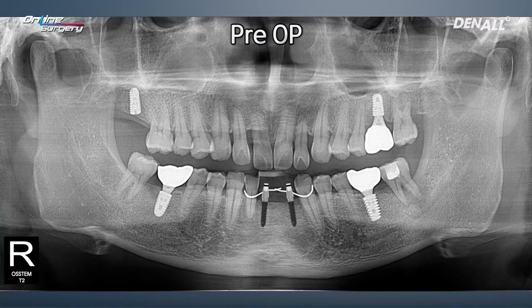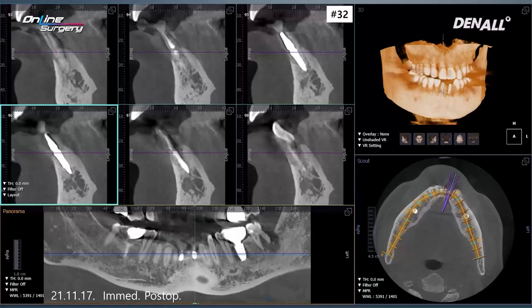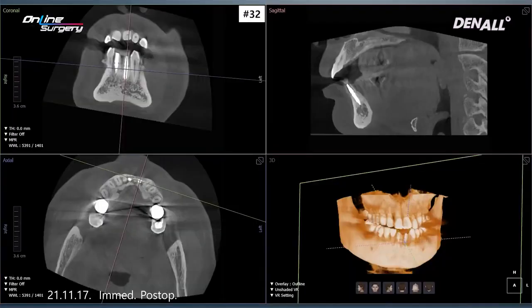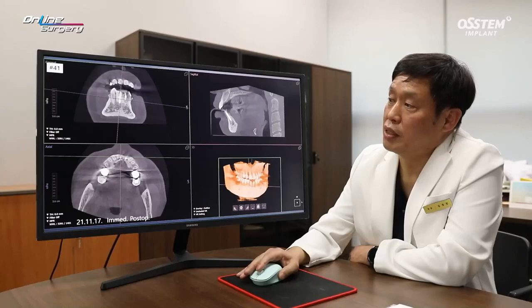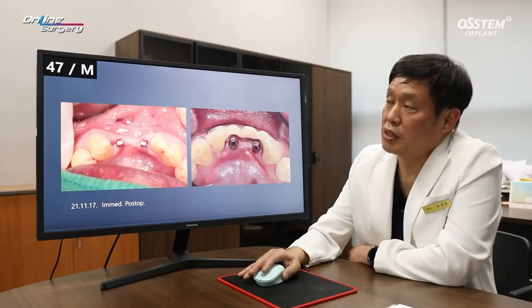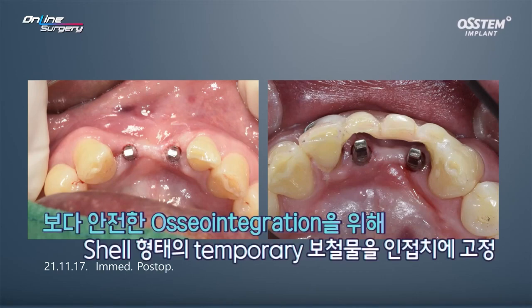As you can see, two implants are planned like this. This is the immediate post-op image. On CT, in number 32, the implant has been placed nicely. In number 41, it has been placed in the desired position accurately. This is the oral image, the immediate post-op image. For number 32, we had done socket preservation, so I thought it might be risky to do immediate temporization. Therefore, I created a shell and fixed it using the adjacent teeth using resin. I thought the risks were too high for immediate loading, so that was the direction we took for temporization.